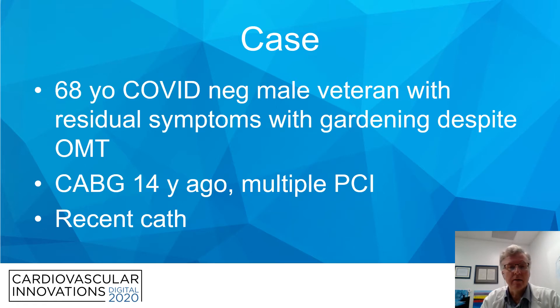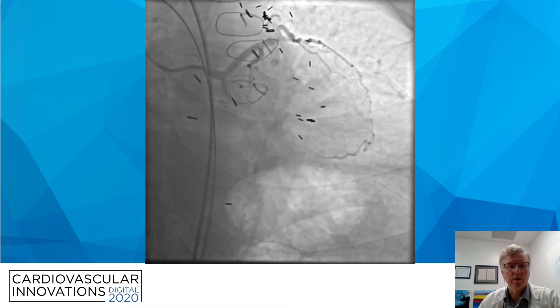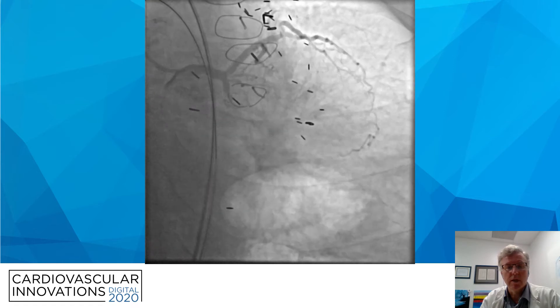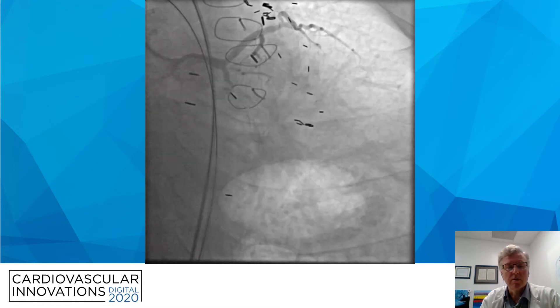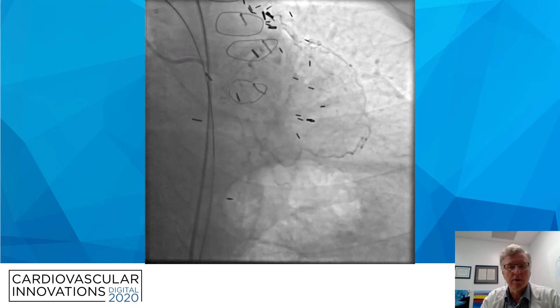On a recent cath, we see that his native circumflex is completely occluded. What you'll notice is that the OM, which fills retrograde from epicardial collaterals from a diagonal, shows an area of tenting with a clip just above it — that's where the vein graft previously inserted. That vein graft has been occluded for at least a year, angiographically.